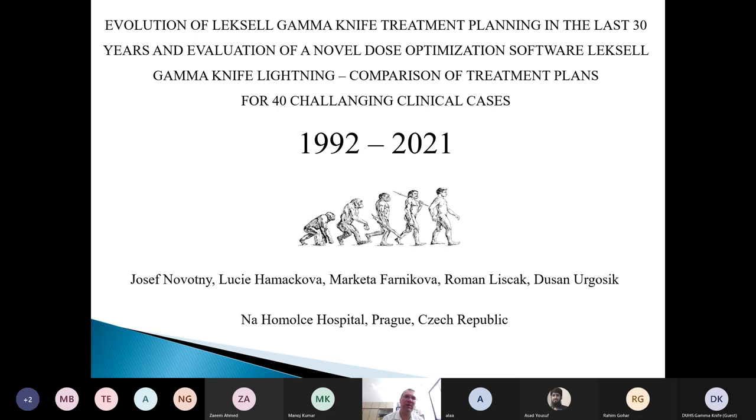As it comes to prognosis, which maybe was also part of your question, especially for metastasis, I think everything is improving. Generally patients are surviving longer and longer, which means they will metastasize. And if we can keep them, talking again about just gamma knife, intracranial problem free, because we can treat those patients multiple times. Sometimes a patient can come again 5, 6, 8 times, every half year, 6 months, for some patients who do have long survival. We can easily treat new mets. They are usually very small, and we can take care of brain metastasis.